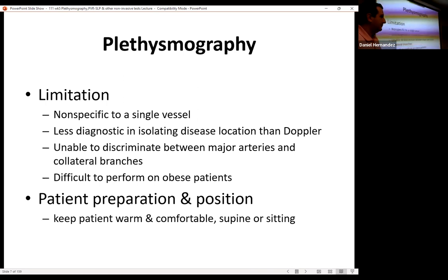Wouldn't that also change the pressures? How many would you need to have a normal pressure though? There should still be a pressure change. The pressures would potentially be different, just this plethysmography portion might look the same. The pressure should be less, yes, but the volume of blood, because you might have a lot of them. The total surface area of them might be enough.